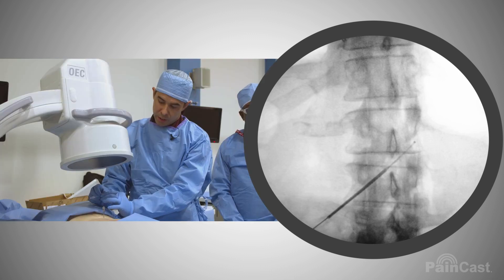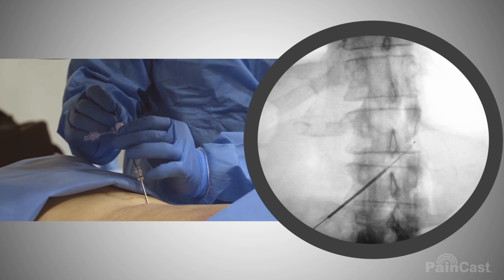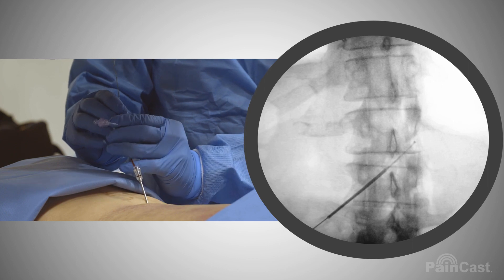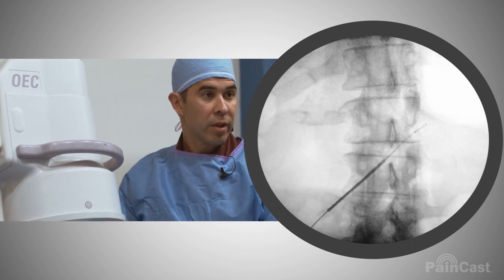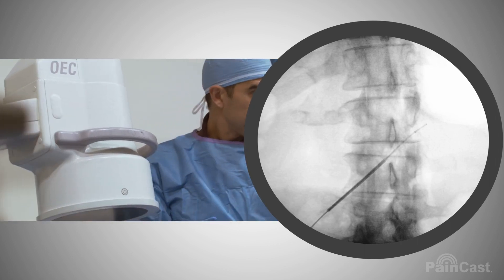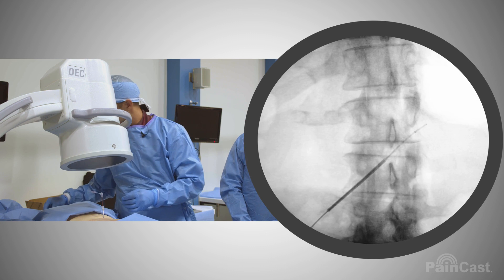We're pretty much right there, so I'm going to unscrew the top of our introducer and gently, with a staccato technique, try to get through the foramen. I felt something pop. We have to be careful not to bend the introducer when we're doing this, so you've got to be really gentle, because if the introducer bends it can be difficult getting the lead in and out.